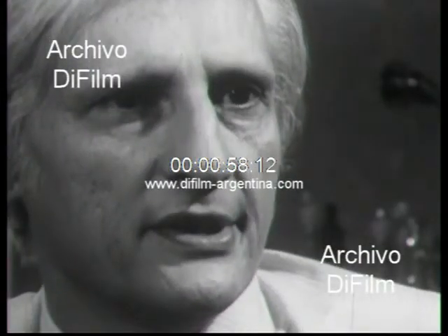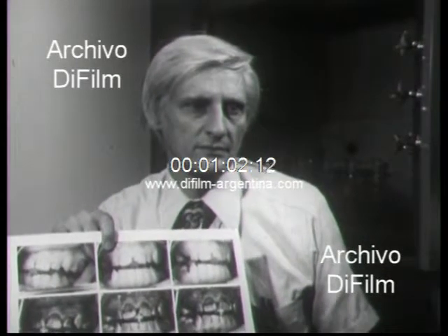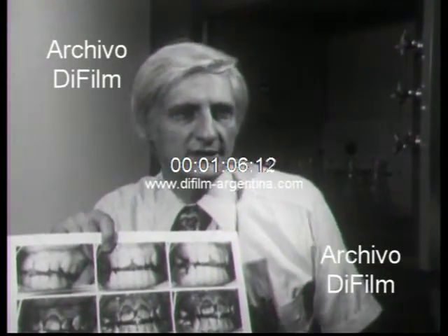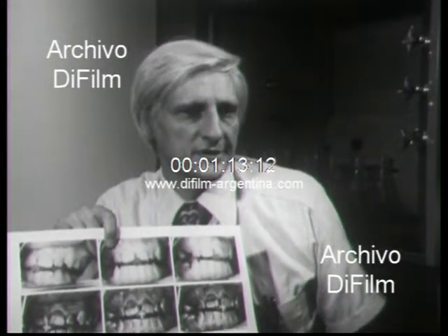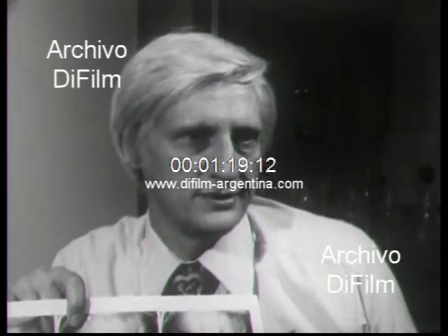The ultraviolet camera was developed by Dr. Israel Kleinberg. He sees plaque control as a major step in cavity control. The ultraviolet camera can be used to locate the plaque that collects on the teeth. This will help a person determine his brushing patterns and the effectiveness of his oral hygiene procedures.